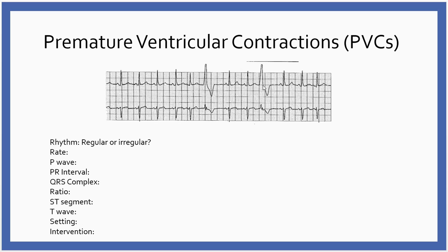What we do look at is patterns of PVCs. Now, right now, you do have 2 PVCs that look about the same, and so when we see morphology that looks about the same, then we call those uniform or unifocal, meaning that we think that it comes from one specific irritable area. Now, if you had another PVC along the way that looked totally different, didn't have this same morphology, then you have multiform or multifocal PVCs, and we think that that means it comes out of 2 different or more than one irritable area, and that might be a more ominous sort of thing.